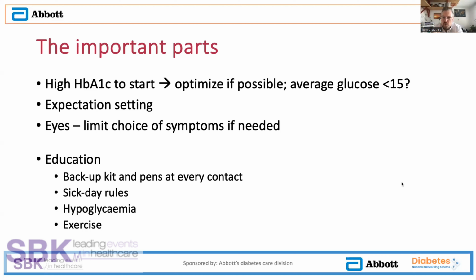And then what we do beforehand is make sure they've got all the education that goes with it. Locally, what we do is a pre-pump session, a team session, and then they've got the onboarding session during which all of these are reinforced. But I try to go through a lot of these during every clinical contact as part of follow-up anyway.